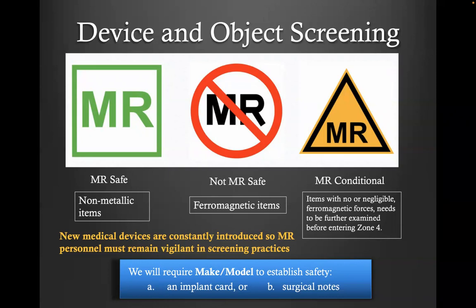And especially, most people here are doing research studies. If it's a clinical study, there are risks, and there is a benefit-risk assessment. A lot of times devices are considered safe enough for the clinical benefit, but for a research study, there is no benefit to the patient. So we cannot assume any risk, right? Does that make sense?